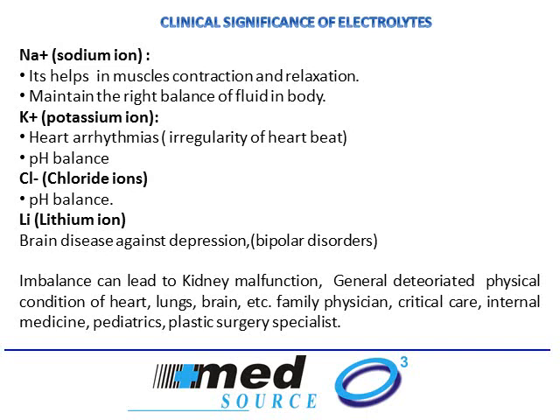Now, while you might be feeling that heart means potassium, it's really not the case. Most usually, you're looking at things like kidney malfunction, general physical health, general health of lungs, brain, etc. Most commonly, electrolytes are ordered as part of either a kidney profile or, even more commonly, in critical care. When somebody has had a trauma or a major accident and there is intensive blood loss, managing electrolytes is very, very important. And therefore, you will see that in trauma centers and emergencies, electrolytes are regularly performed.